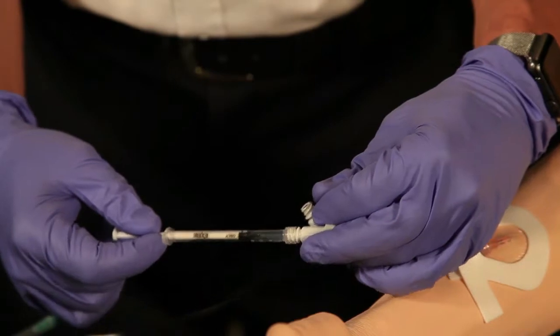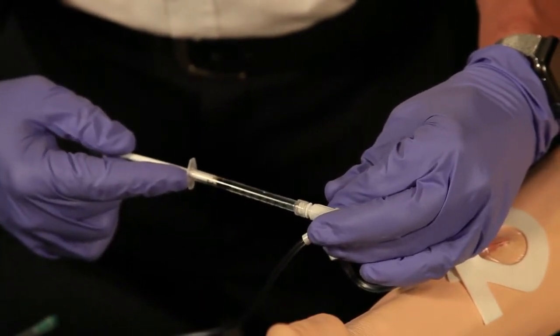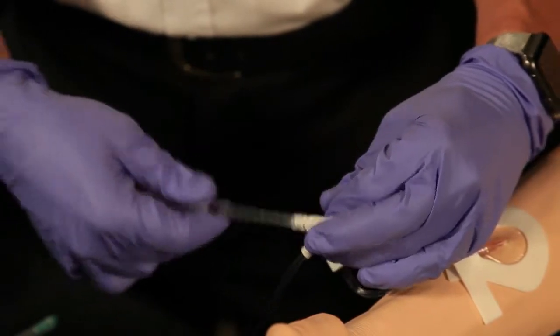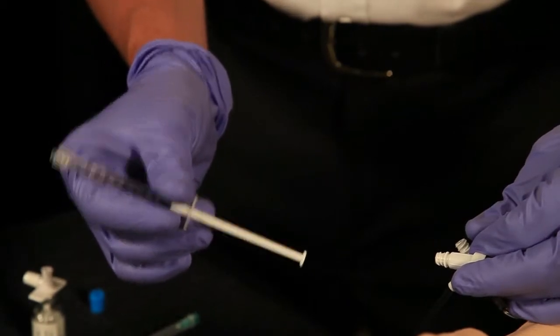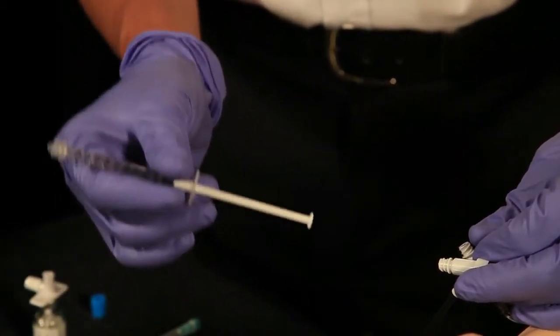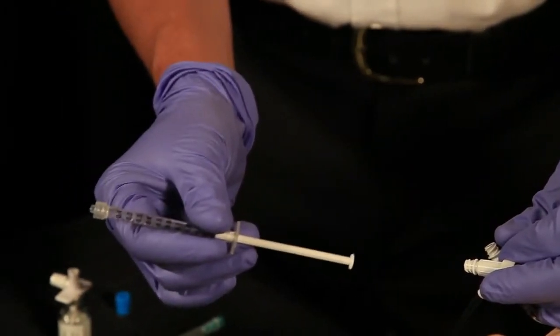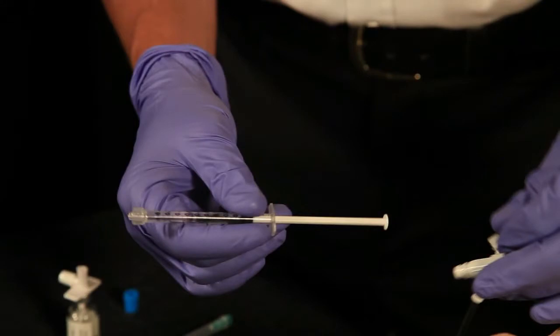So we're going to go ahead and pull back now. As you can see, we're pulling straight saline into here. And then we would actually have 0.25 mLs of ketamine, which is 25 milligrams, and 0.75 mLs of normal saline. And that would be our dose, 25 milligrams for pain management. Now we would go ahead and deliver this to our patient over 1 minute's time.